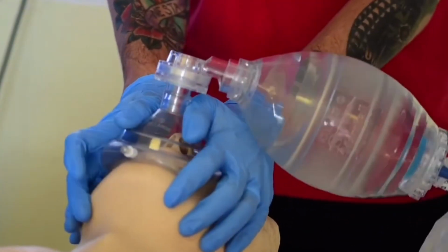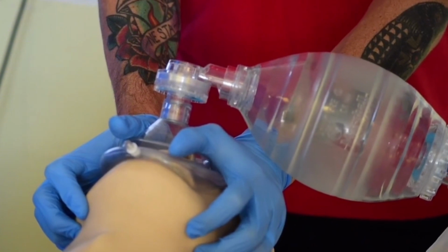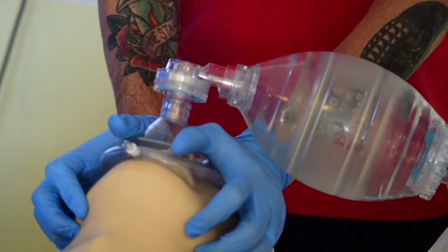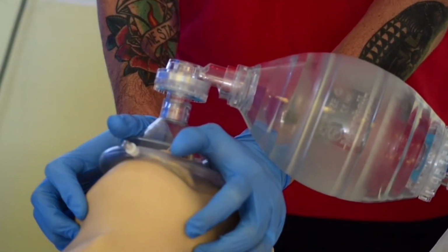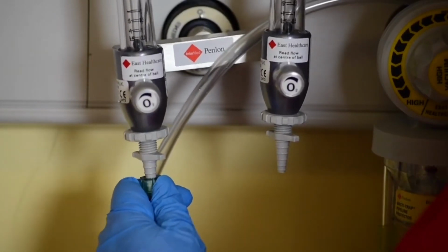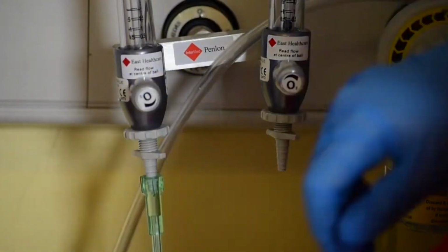Patients with a low respiratory rate or who have depressed consciousness and airway obstruction will almost certainly require supported ventilation, provided initially with a bag valve mask device. The device can be used without an oxygen supply to ventilate the patient with room air, but a supply of oxygen should be obtained and attached immediately and turned up to deliver 15 liters per minute.